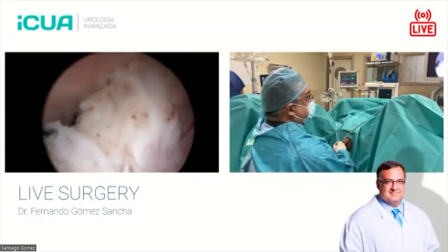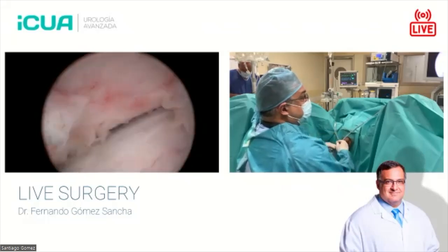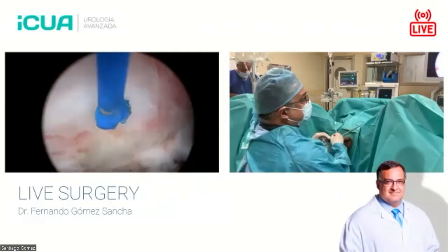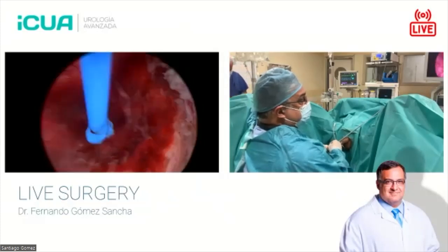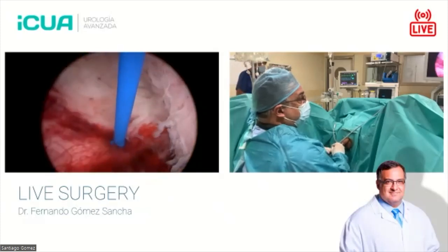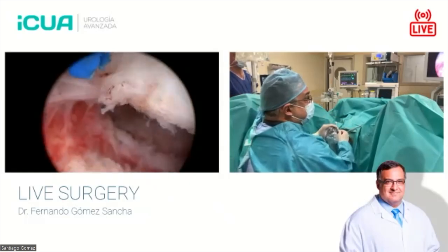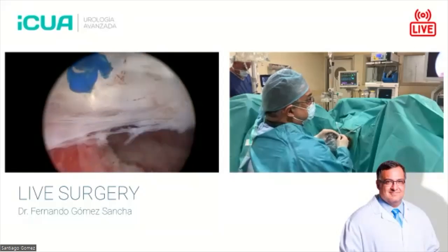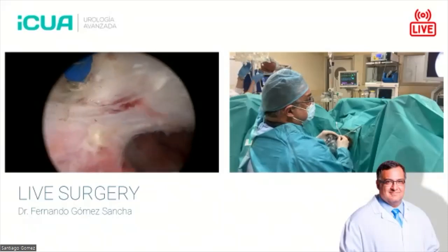Okay, here again, I'm going to show you what I do to tilt the prostate. This is the lobe. I'm going to lift it a little bit, so when I push it, it's not against the bladder neck. So here I will push a little bit, and now the lobe has tilted. This is the prostatic urethra. This is the bladder neck. So now this lobe is in the bladder. And when I come below to check this side, I can see much better what's going on. You see there was some little attachment here. So I can do a better dissection now.